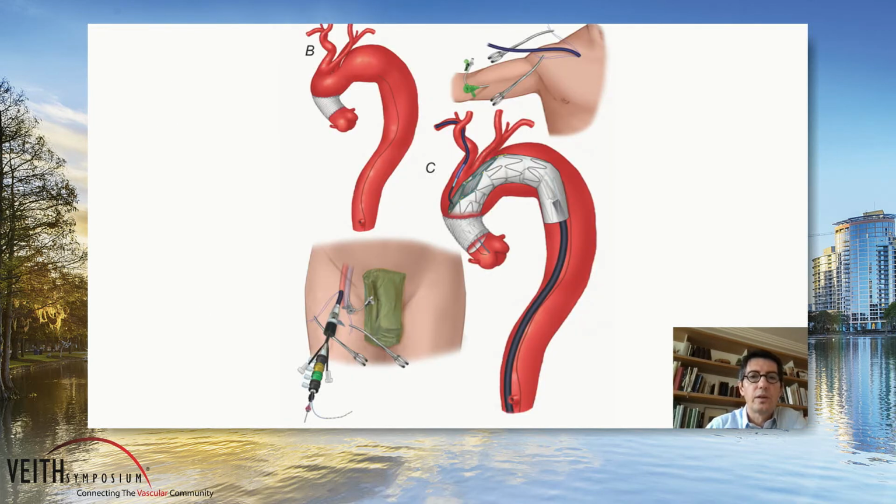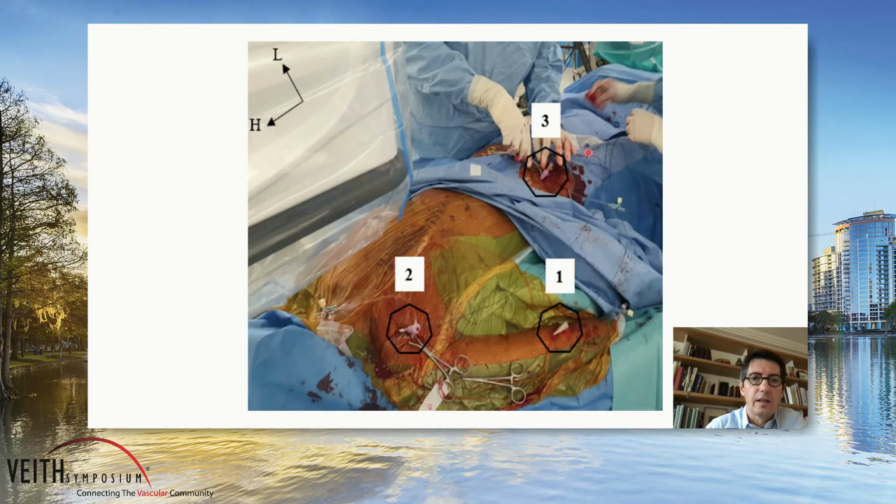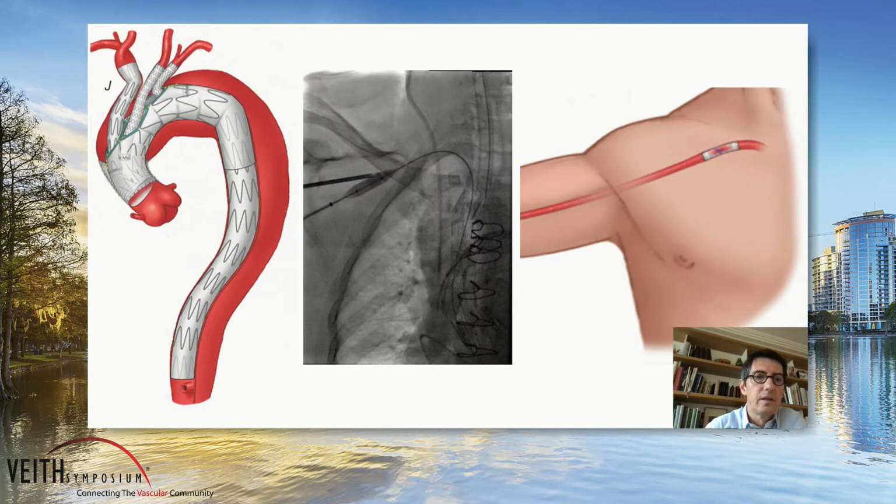This is how we do it. We do a percutaneous puncture of the right axillary artery and position two Proglides. We secure that approach with a right brachial sheath. You can see the access to the groin, femoral artery and vein, a right brachial artery access, and right axillary access here. And at the end of the procedure, if the Proglides don't work perfectly, because of the right brachial approach, we can position a short covered stent to get a seal.